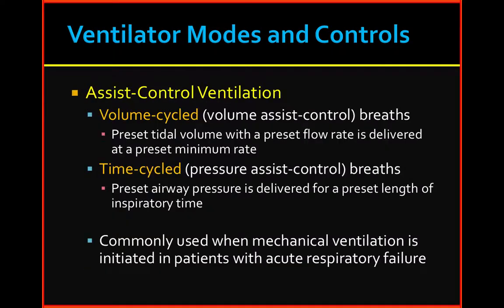Assist control is mostly done by volume cycle. It's commonly used when mechanical ventilation is initiated in patients with acute respiratory failure, and it's mostly used in all the medical and surgical ICUs.